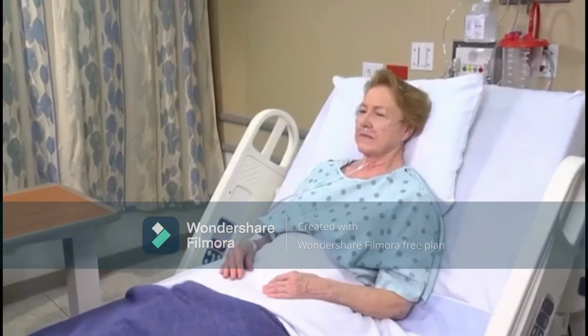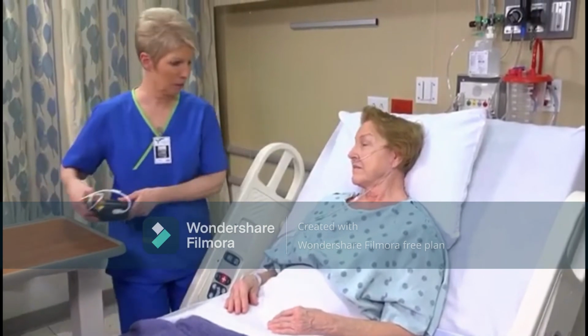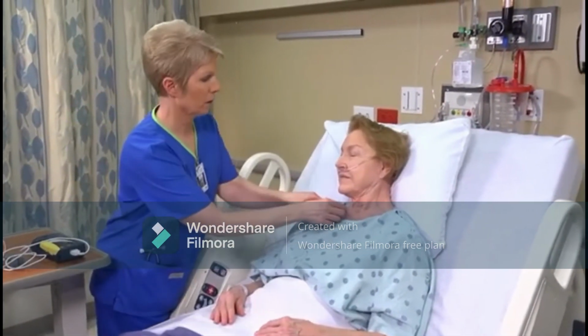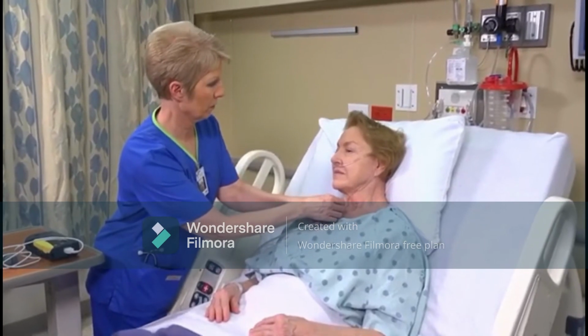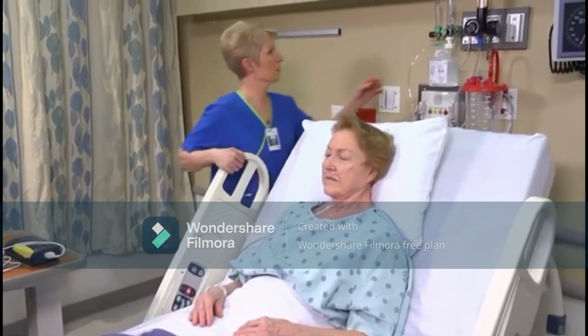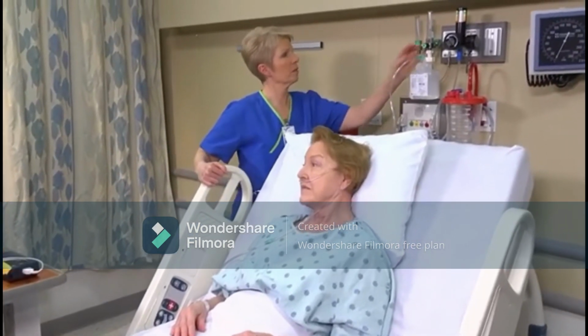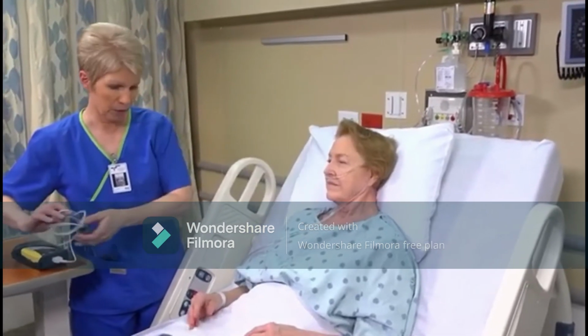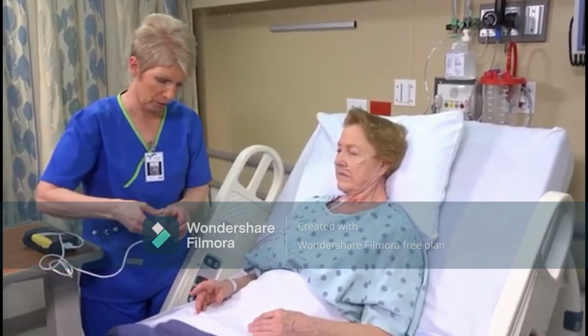As part of your follow-up care, check the cannula or face mask every 8 hours and keep the humidification container filled with water. Monitor the patient's pulse oximetry and arterial blood gas levels, if needed. Make sure your oxygen is going at 5, and it is. I'm going to check your pulse ox one more time to see what your oxygen saturation is. Okay.